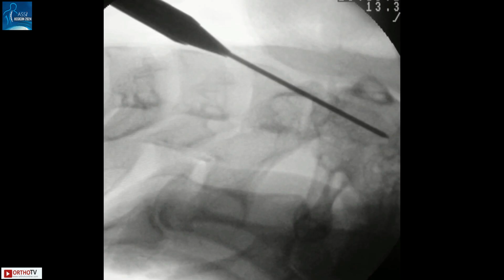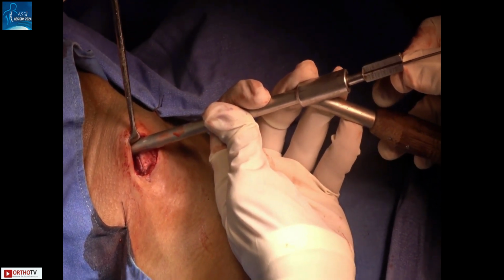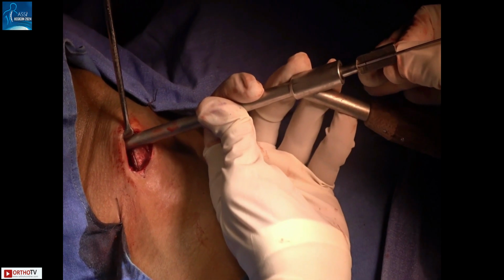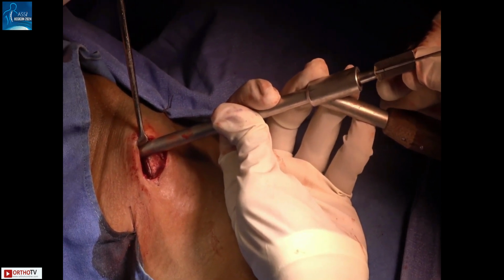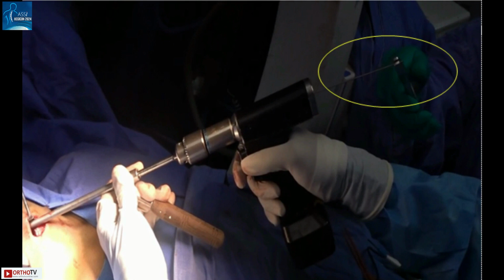The guide wire is then advanced in both lateral and AP view to the tip of the odontoid. Be very careful that it does not cross the odontoid, because next will be the junction of the medulla and this can have serious consequences. You measure the length by using the measurement devices, and then you have to use a power instrument to drill over the cannulated instrument.